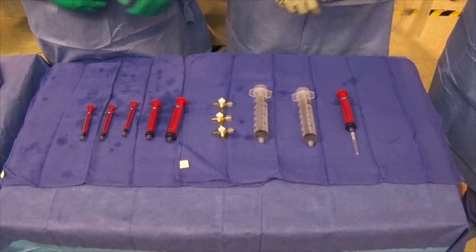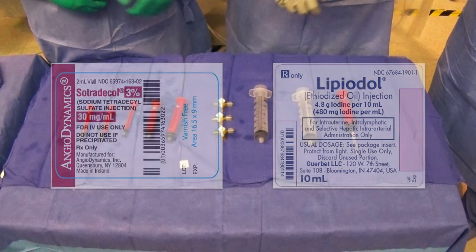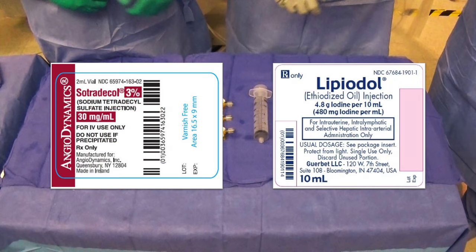This is a typical setup. We will use 20 milliliters of 3% Sotradecol, which is a concentration of 30 milligrams per milliliter, or 600 milligrams. We will also use 10 milliliters of Lipiodol, which is 4.8 grams of iodine, in poppy seed oil. Note that this is an off-label use of this medication.